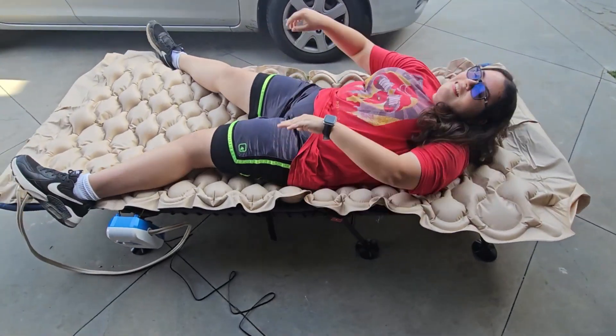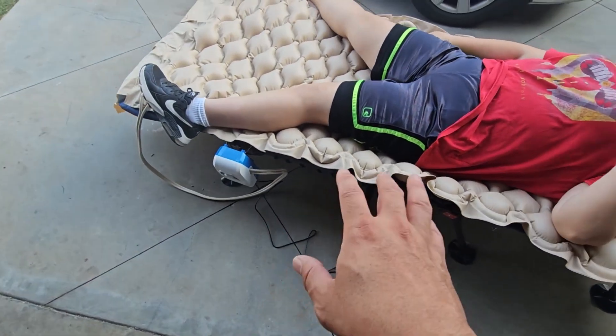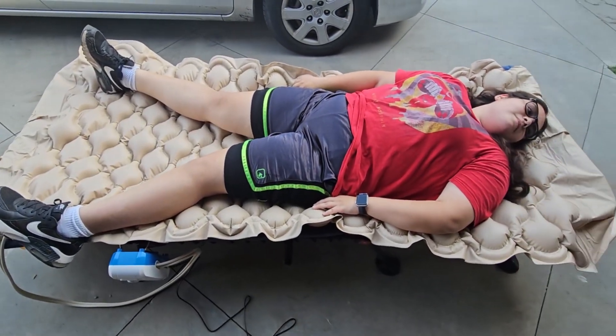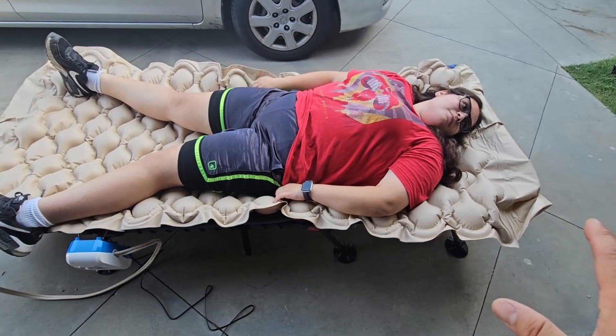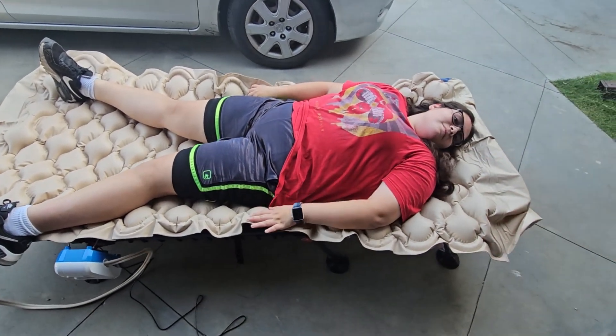So here we have the actual bed — it doesn't deflate because the automatic machine keeps the air nice and soft. The only thing I recommend is maybe put a couple of sheets over it, because this is plastic and if you sweat that can be an issue, but other than that it's great.